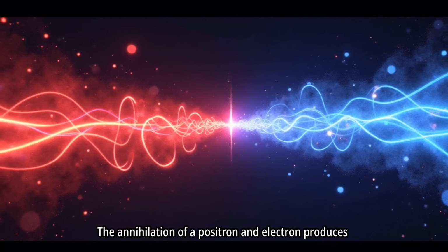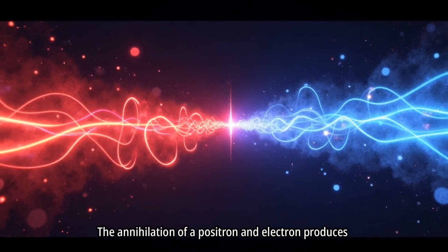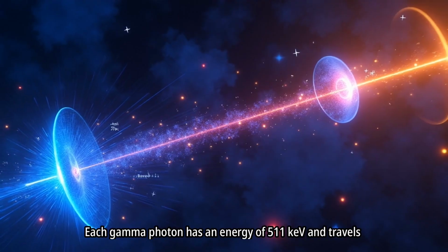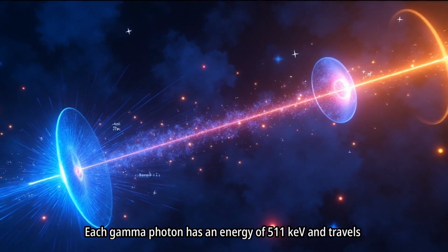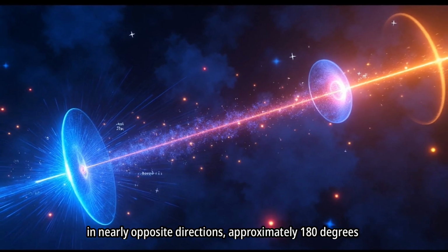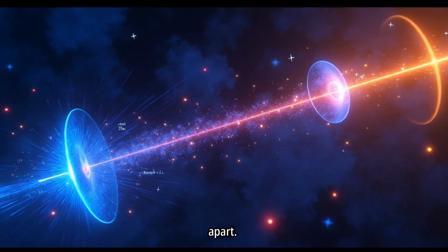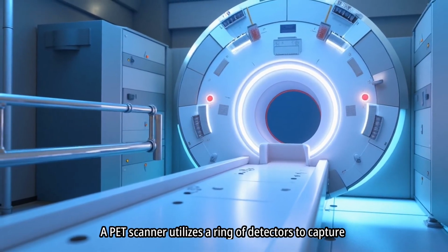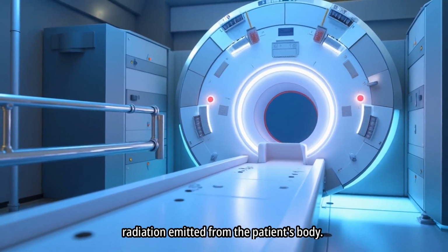The annihilation of a positron and electron produces 2 gamma photons. Each gamma photon has an energy of 511 keV and travels in nearly opposite directions, approximately 180 degrees apart. A PET scanner utilizes a ring of detectors to capture radiation emitted from the patient's body.